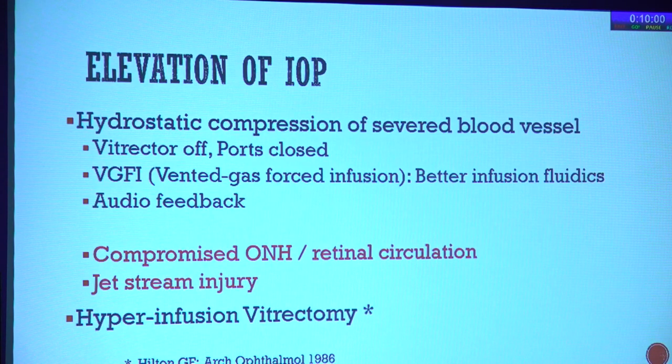So the things that you need to note is when the hydrostatic compression of the severed blood vessel is induced by increasing the IOP, the vitrector has to be off. If the vitrector is on and continuously having a vacuum mode on, it will not create the kind of IOP that you want to have.